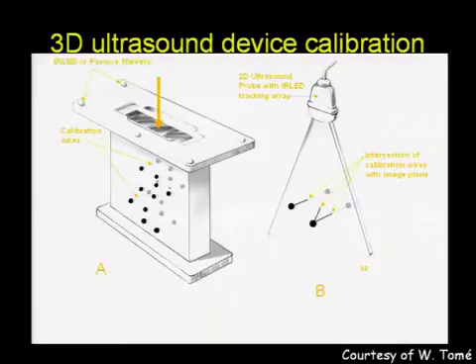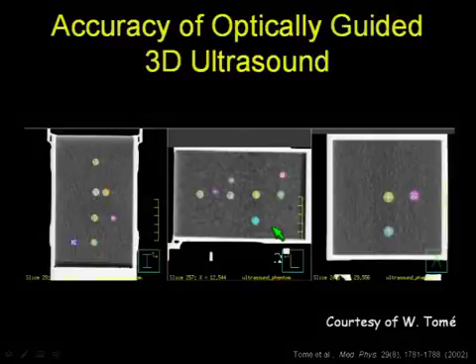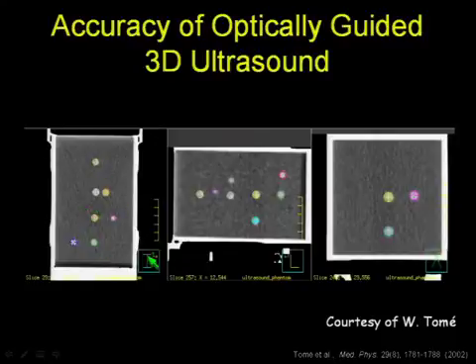Okay. This slide shows again a phantom that is built specifically for ultrasound. It consists of an ensemble of objects of known places and positions that can be imaged under ultrasound and can be compared subsequently with a reference CT data set of the phantom, and can be assessed for reproducibility of positioning accuracy. Also, all vendors offer a phantom of this kind.